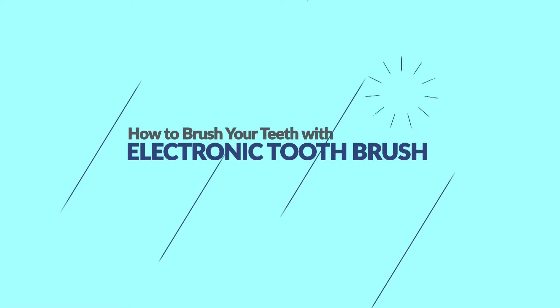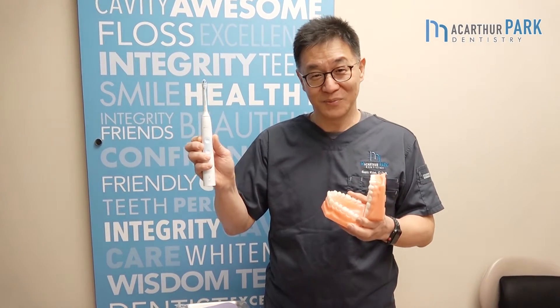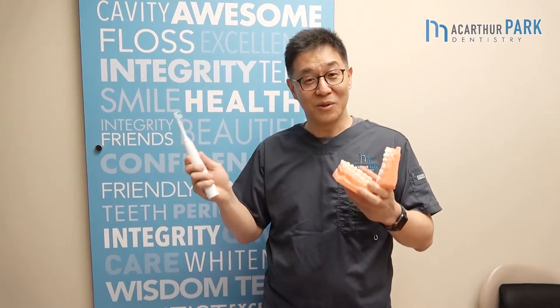Hi, this is Dr. Sam Ku at MacArthur Park Dentistry in Las Colinas, Irving, Texas. Today I'd like to show you how to brush your teeth with Sonicare. This is what I recommend over other electric toothbrushes. I use it every day and I get great results.